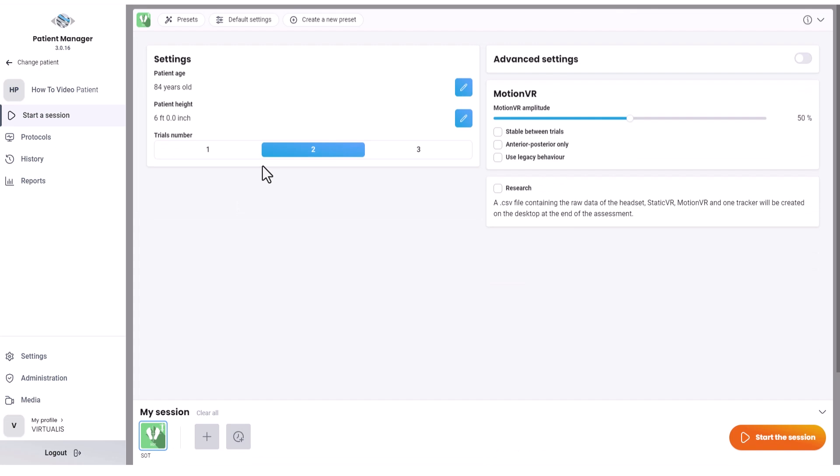Next, select settings in the software. Keep the default settings, including at least two trials of each condition.